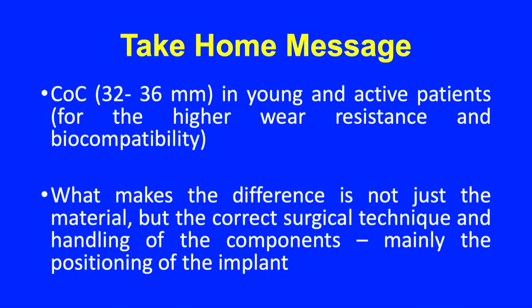The complication rates definitely have gone down, especially fractures, and one has to say it's not the material. For any technology or technique or any prosthesis you're using, it's the surgical technique, handling of the component, and positioning of implants which matter mainly. If you have all these three things, whatever implant you're doing, whatever material you're using, you'll have excellent results. Thank you so much.